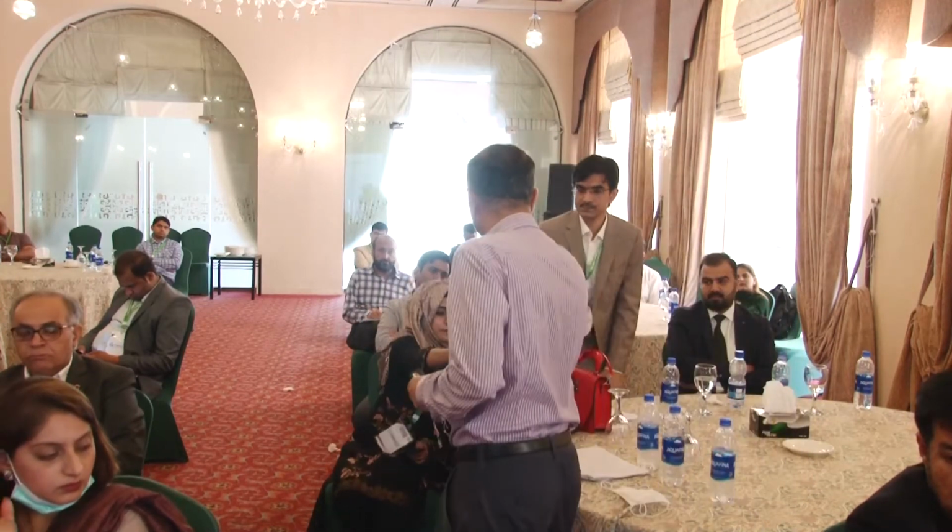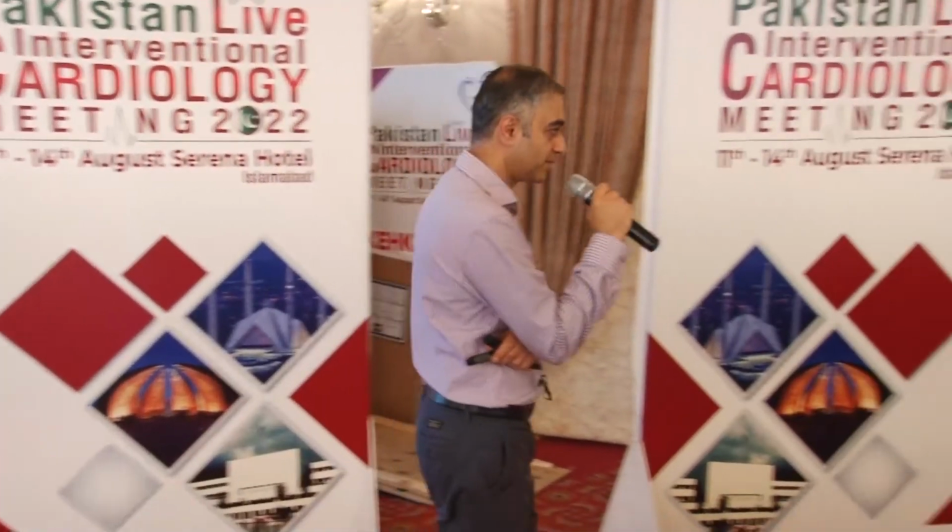If there is a heavy calcification of the vessel, because the ultrasound waves cannot pass beyond the calcium, we can't see anything beyond it. So how do we calculate the area of the vessel and the plaque burden? Yeah, again, a very good question. You can't basically, because to calculate the plaque burden, you have to be able to see your media. Yeah, so you can't in that situation. All you can do is calculate lumen size.